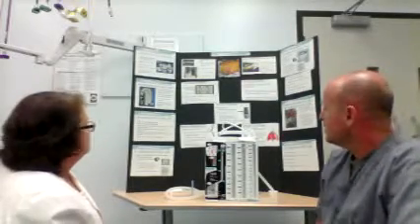If it's a suspected or known hemothorax, the gown and the face shield are imperative, because if you have a liter of blood in that pleural space, when you pop in through the pleura, guess what? I've seen them in the emergency room, and it comes out and makes a mess, and you don't want that blood in your eyes. As soon as you open that chest cavity, the blood just comes pouring out. So the PPE is quite important. So don't forget that.